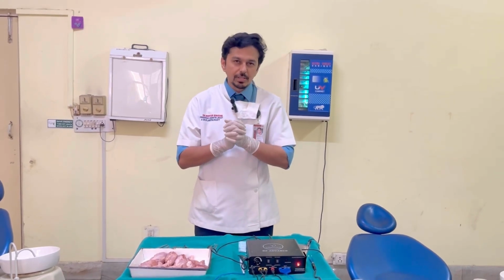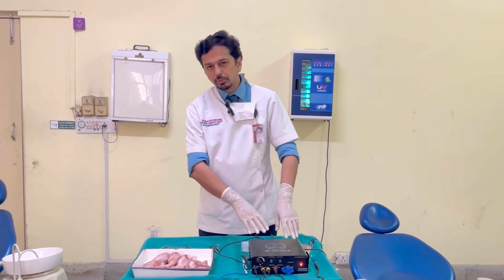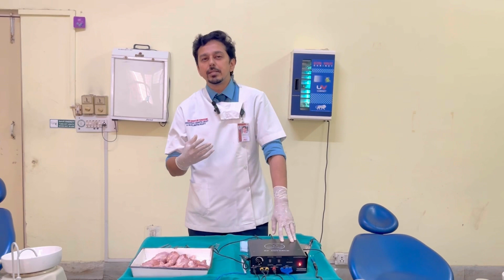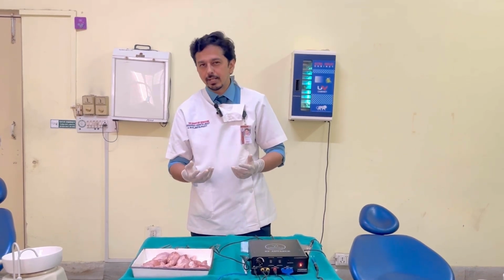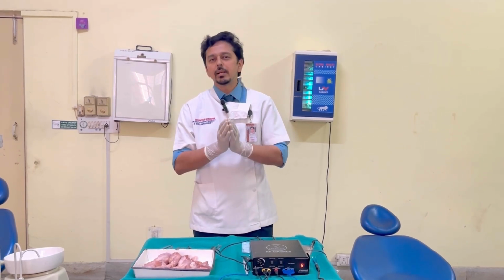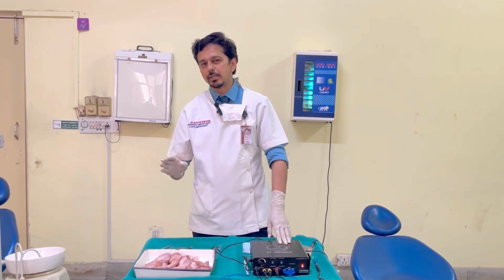One final point is that many a times a few marketing gimmicks are there with regard to thermal modalities, especially laser. So what they say is laser is painless, thermal modality does not require anesthesia, etc. All that is a gimmick. Please understand, a cut is a cut, be it by blade, electrosurgery or laser.